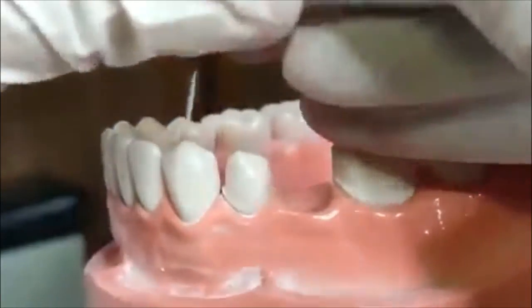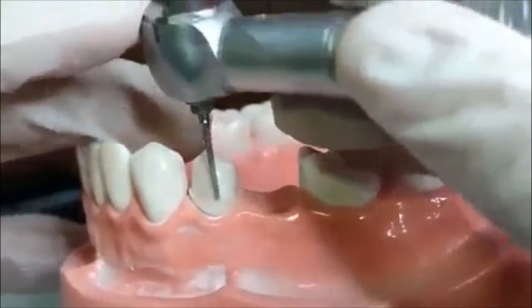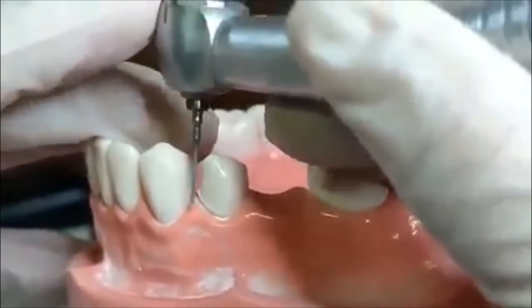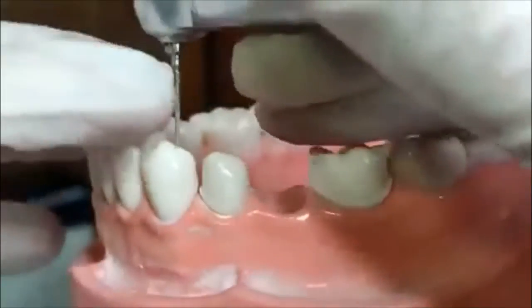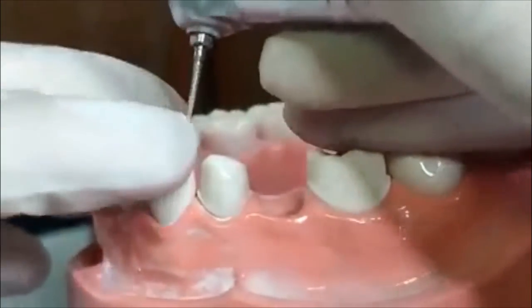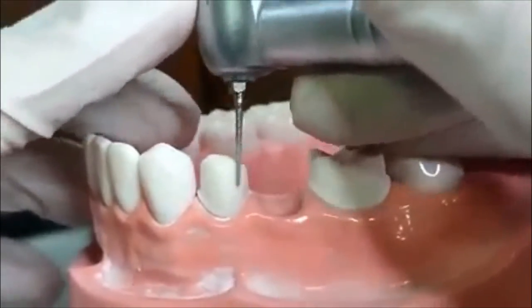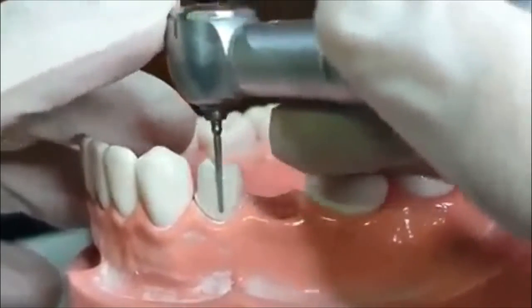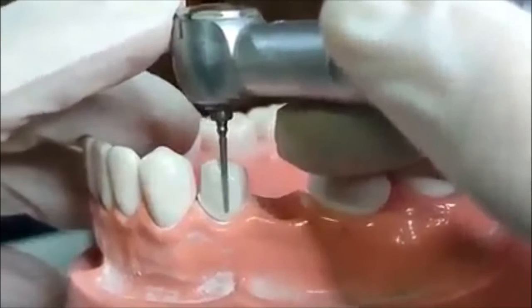Okay, one side is done. You can see I just kept my burr straight — hindi ako gumanoon, just straight. So just letting the burr do the cutting para nasaan lang tumama yung tip and the upper body, it will cut. So let's move to the other side, paas mo na, then switch the burr.